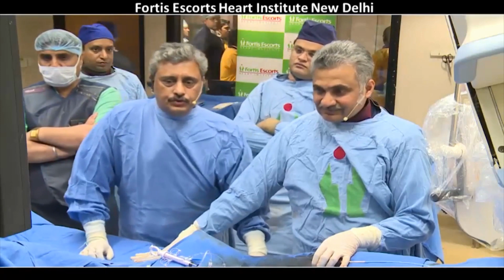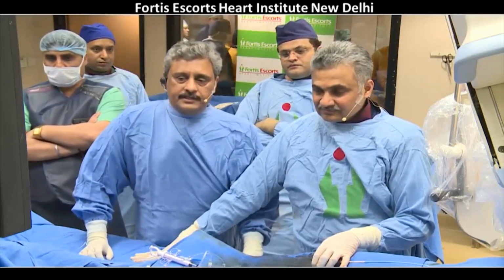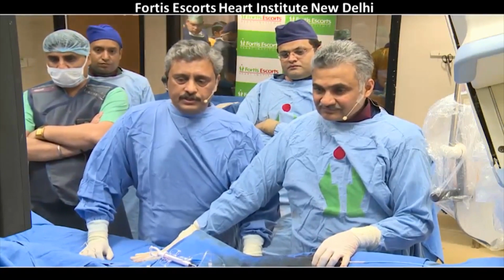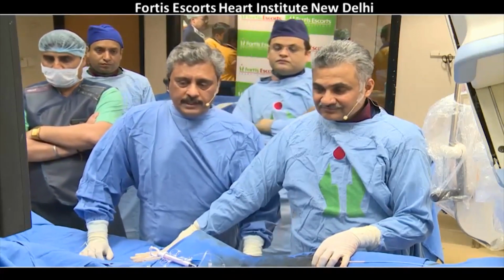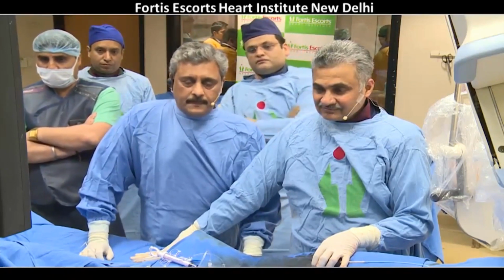So the issues involved in this case were that this is a diabetic patient. There is stenosis, maybe a restenosis, in the proximal edge of the previous stent in the circumflex. And since the balloon was slipping backward and forward, there appears to be a relative amount of fibrosis.